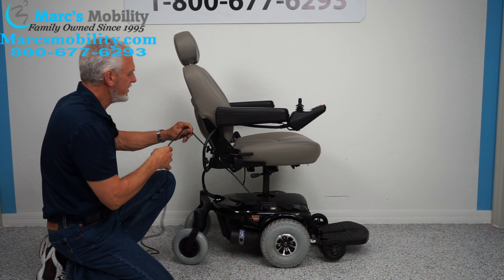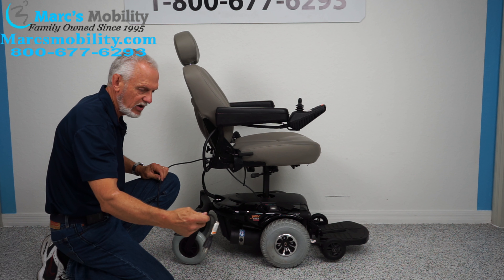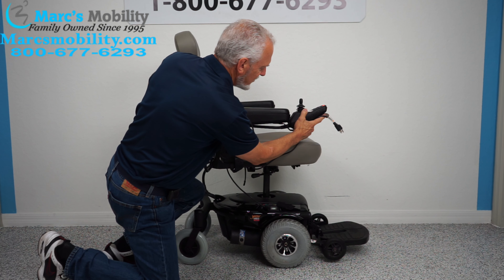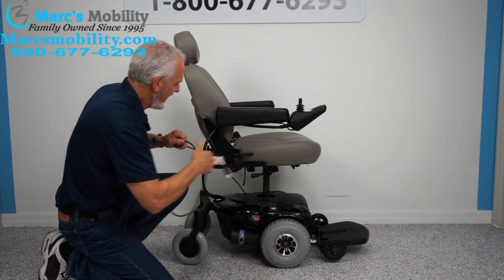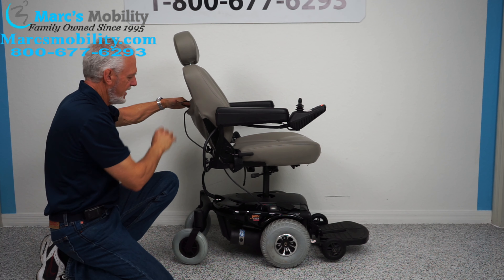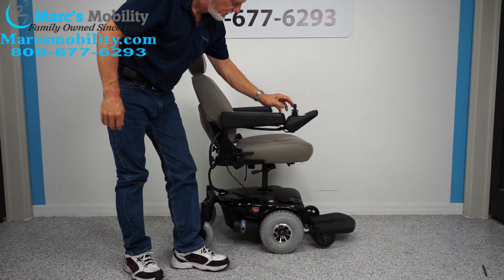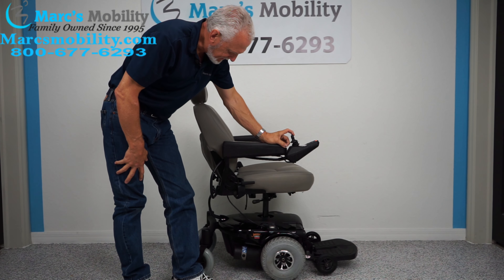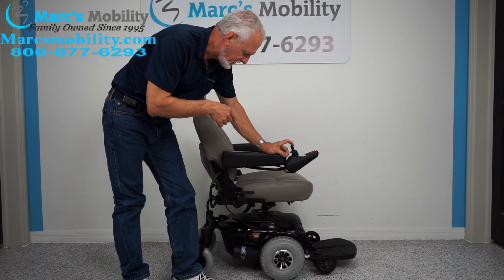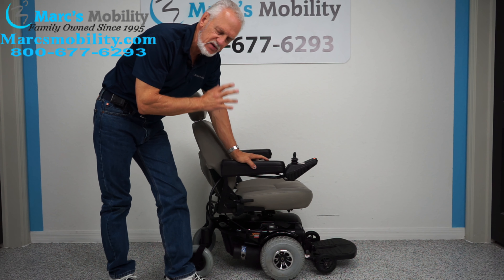We have here a beautiful Jazzy 1103 Ultra — this is an oldie but goodie. This power chair has one mile on it, making it practically brand new. It has a five inch seat lift, which makes it the smallest power chair you're going to find for inside a house with a five inch seat lift.